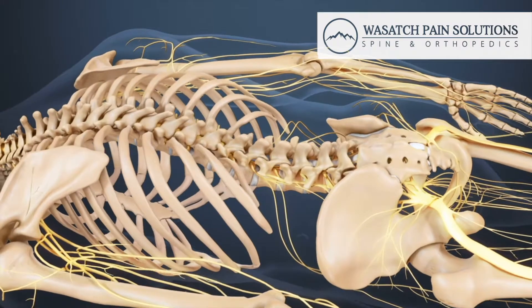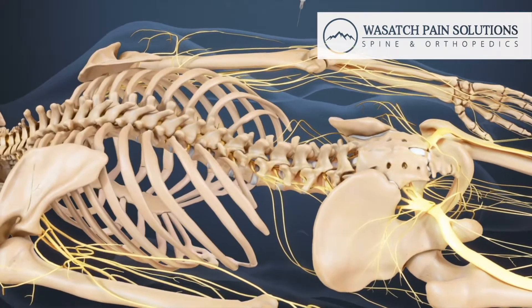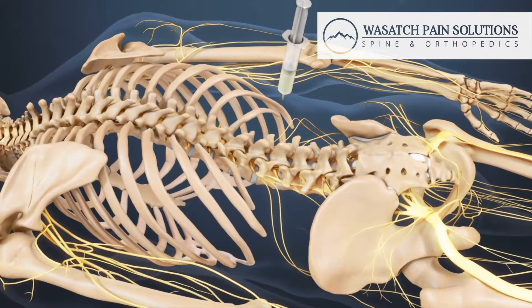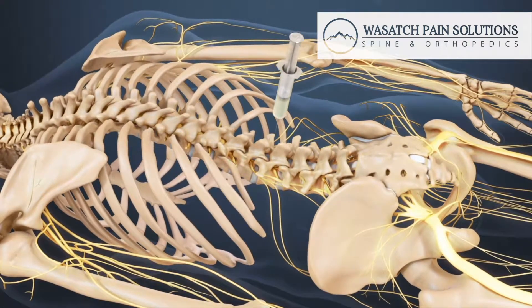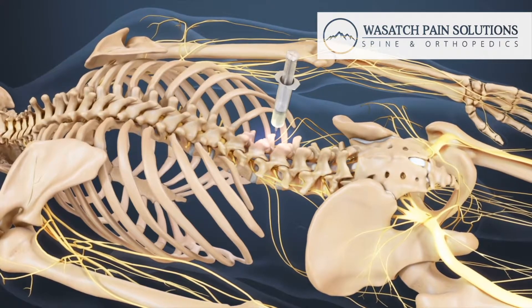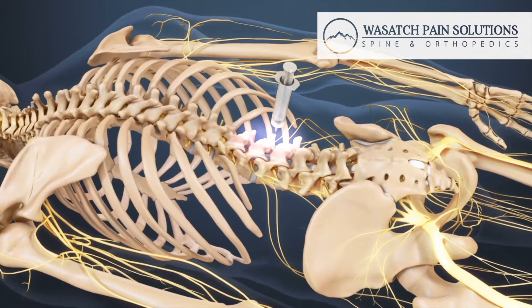The first step in the process is a trial period of spinal cord stimulation. The person is sedated, given a local anesthetic, or both.